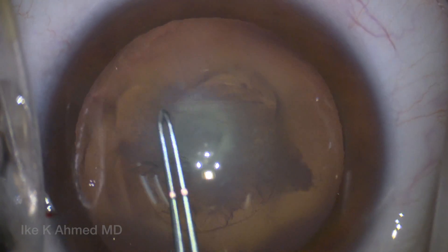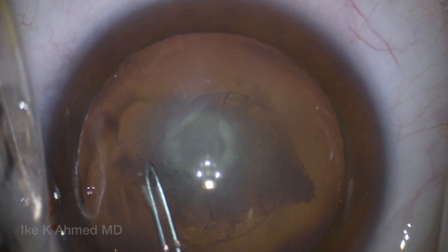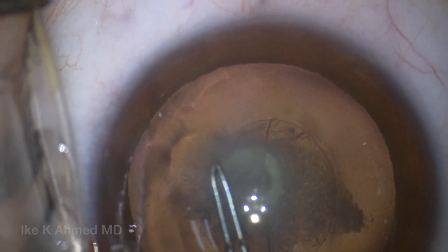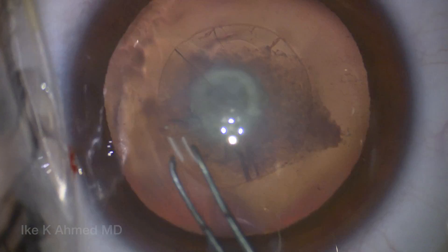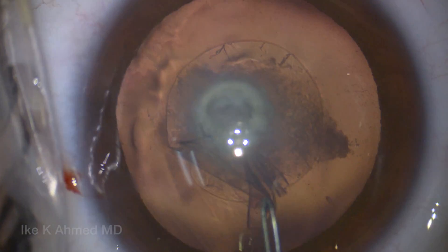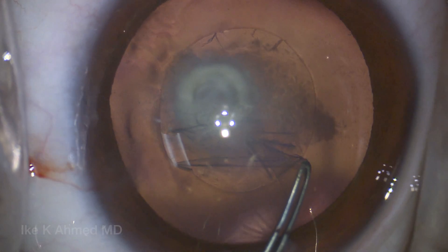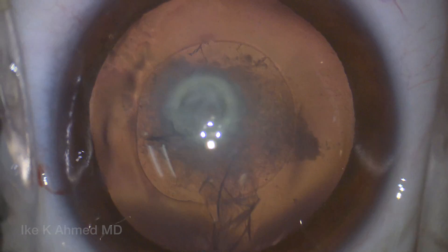It's important to ensure that the capsulorexis is adequately sized. In this case, which is actually somewhat of a megalocornea case, we have achieved here about a 5 to 5.5 mm anterior capsulorexis. This is important if we decide to capture the intraocular lens in an optic capture position in the anterior capsule, should the posterior capsule be deficient or unusable.